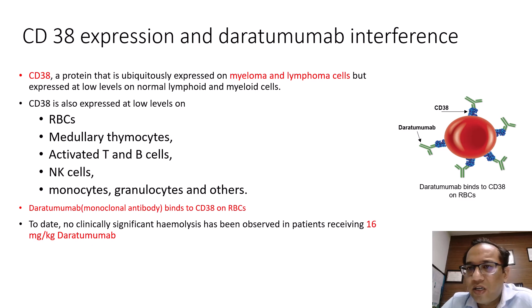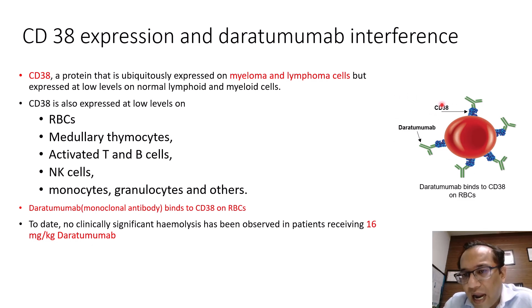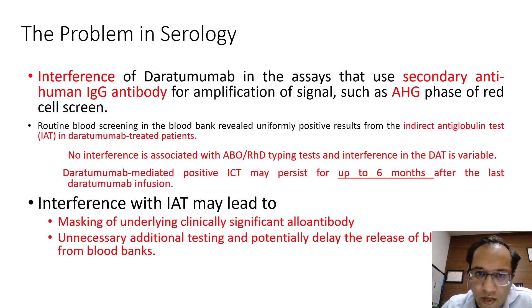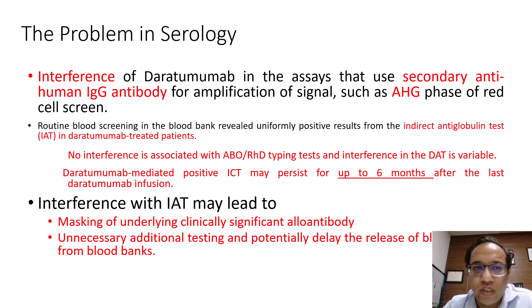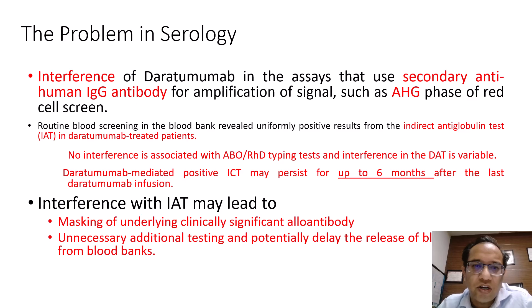CD38 is expressed on medullary thymocytes, activated T and B cells, NK cells, monocytes, granulocytes, and others. Daratumumab binds the CD38 present on RBCs, and when we add anti-human globulin as a secondary antibody, this gives a positive — or false positive — result. The interference occurs in assays that use secondary anti-human IgG antibody for signal amplification, such as the IAT phase of the red cell screen. Routine blood bank screening reveals uniformly positive indirect antiglobulin test results in daratumumab-treated patients. There is no interference with ABO and Rh grouping, although the DAT result is variable.